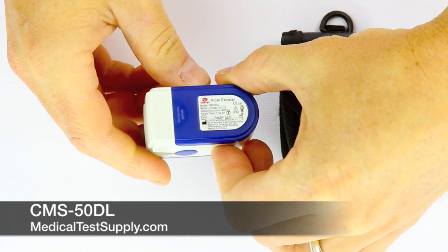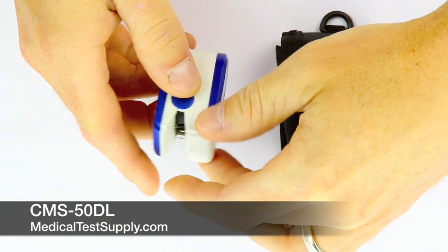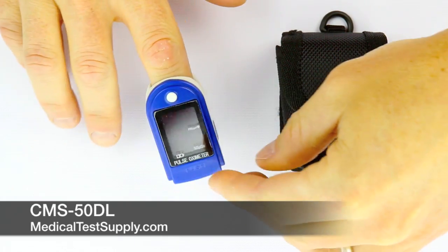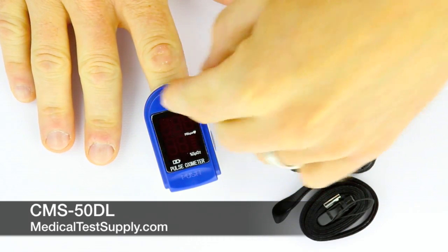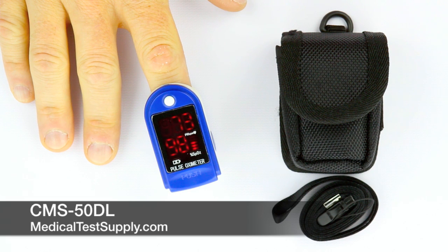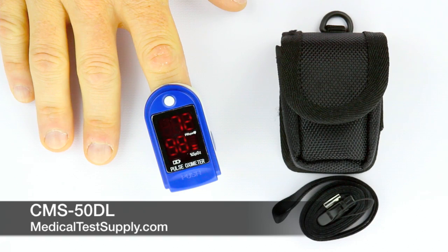This oximeter can be used by anyone requiring spot checks of their oxygen saturation and pulse rate. It's a great device for fast checks at medical facilities, when you're at the gym, flying an airplane, or certainly as a home health care device. As can be seen in this video, this person's pulse rate is 73 with an oxygen saturation rate of 98%. The moving bar on the right side indicates the person's pulse strength.